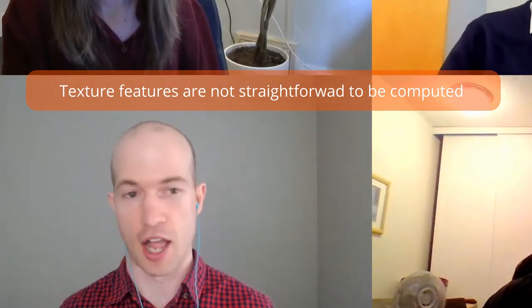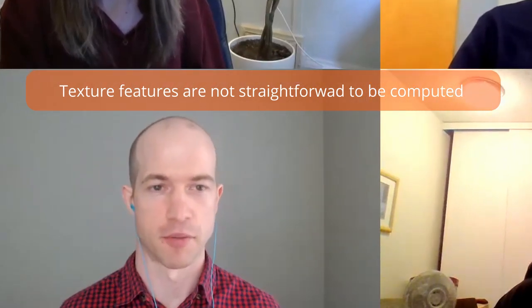In terms of clinical application, I think the first approach really needs to be the validity of these measures before we transition to clinical aspects. But even once we do that, there are different software approaches. Echo intensity is easy. If you measure echo intensity using one software versus another, you're likely going to get the same result. That's not the case with these additional higher order texture features.